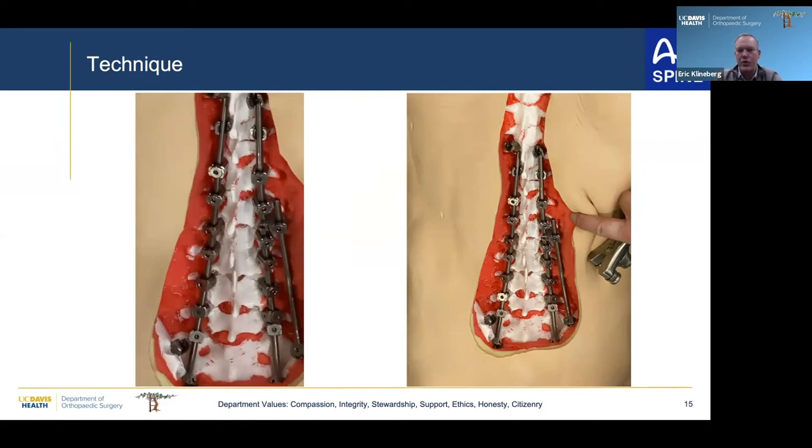And so you can loosen the distal screws or proximal screws and lengthen or compress that right side of the spine to do any fine tuning. And that sometimes is a pretty clever way to get a couple degrees one way or the other, to make sure that you've got things lined up together properly and not have to take all of the implants out. So again, we're using it as a true kickstand technique.